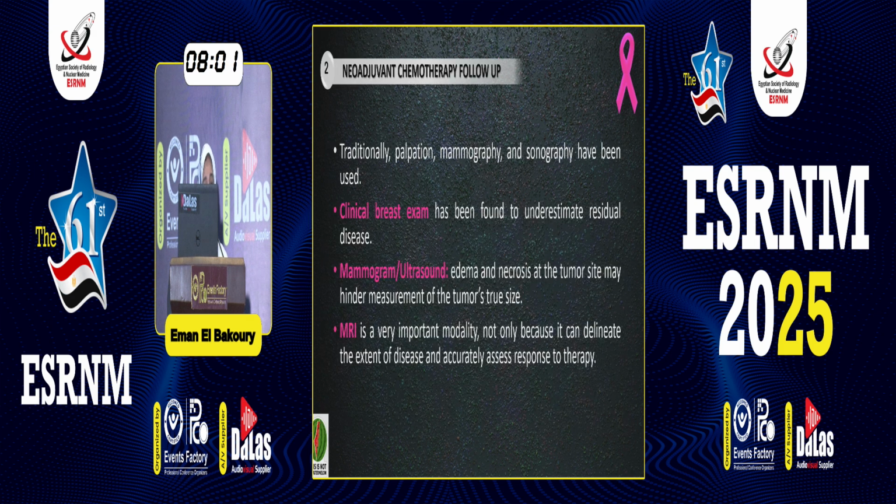Our next section is the neoadjuvant chemotherapy. Historically, we have the clinical examination for assessment of the neoadjuvant. However, nowadays, we all have gone through the scenario where the clinician tells the patient, she is free now, and you just put the probe to see a 2-centimeter mass still there, okay?